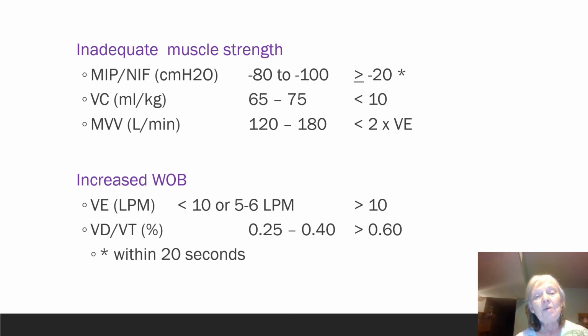So this is not one of those things that you go into and go, okay, let's do this really quick. Yeah, that was okay as far as that goes. That's really, really bad too. You have to coach these patients, and you're going to do them for greater than within 20 seconds at this particular point in time, okay?